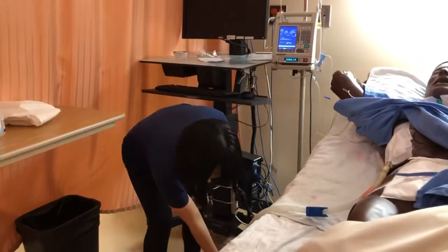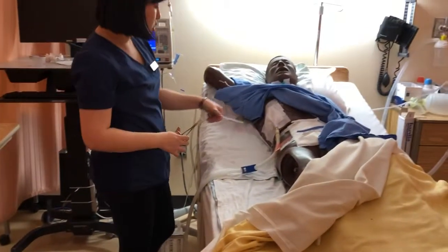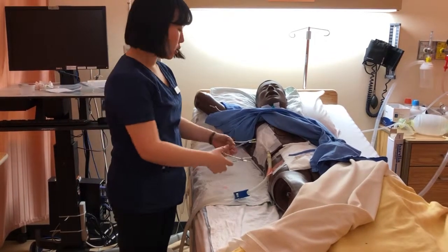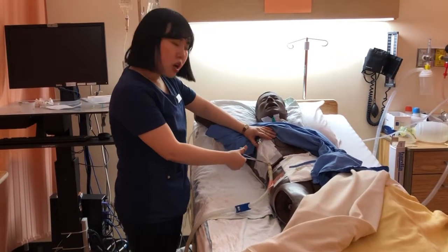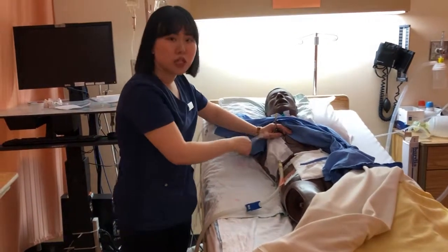If the bubble is fluctuating a lot, that means there is air leakage in the chest tube. So how would you check is you're going to check the patient's dressing site. The dressing is dry and intact, but then you're going to clamp it here. If the bubbling stops, that means the leakage was from the dressing side.